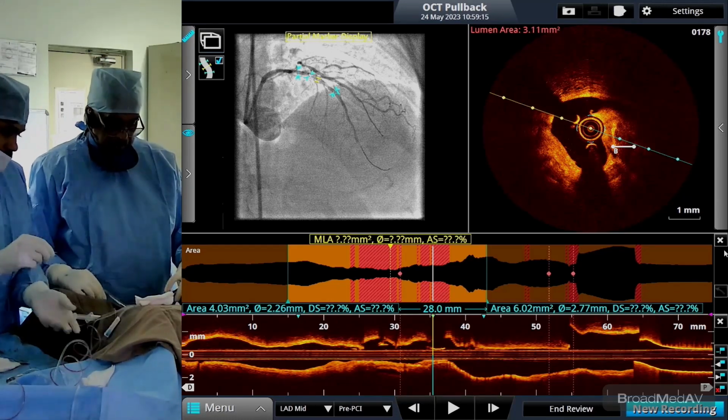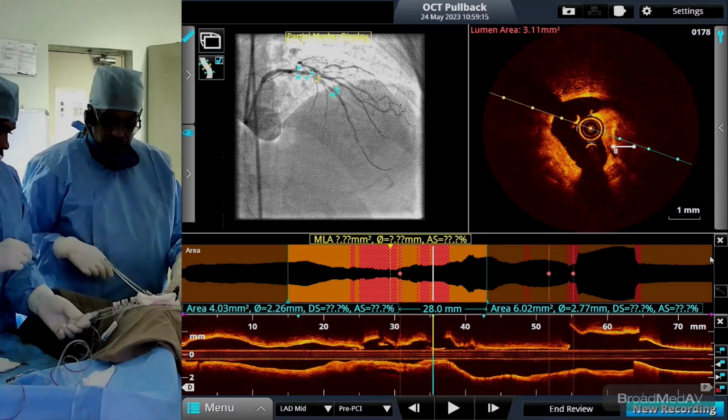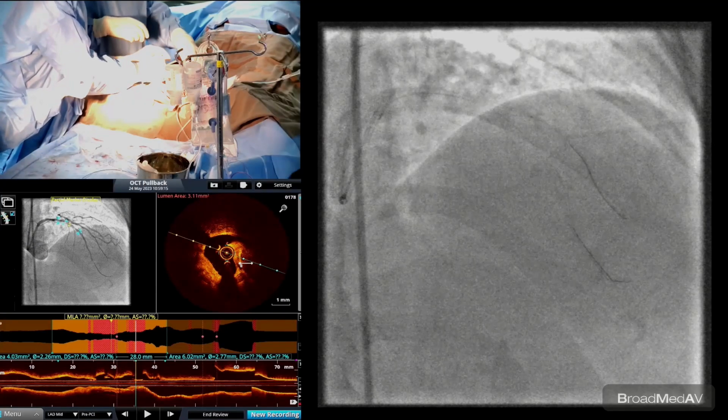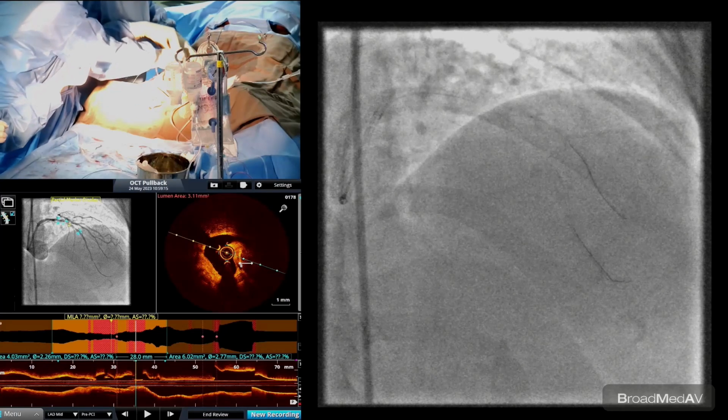Okay, so basically what Dr. Nandakumar is saying is that it's spotty calcium, not deep plates or nodular calcium where we need some debulking strategies. A plain balloon with a 2.5 was good enough. Yeah. And we're going to do the diagonal because the diagonal is diseased.